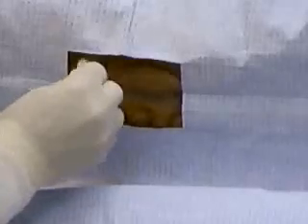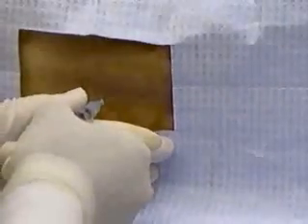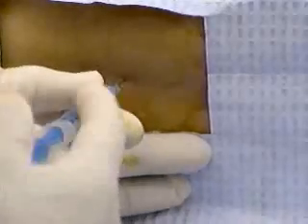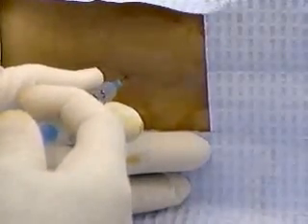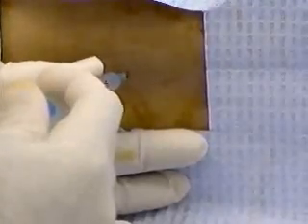At this point, some physicians recommend changing to a fresh pair of sterile gloves. Wipe away the betadine — some physicians think that washing off the betadine reduces the incidence of post-puncture headache. Palpate the back once again to confirm the level of your chosen interspace. Draw up the local anesthetic into a syringe. Warn your patient that the anesthetic may burn when it is injected. Using a 25-gauge needle, inject about half a milliliter of anesthetic into the superficial tissues.